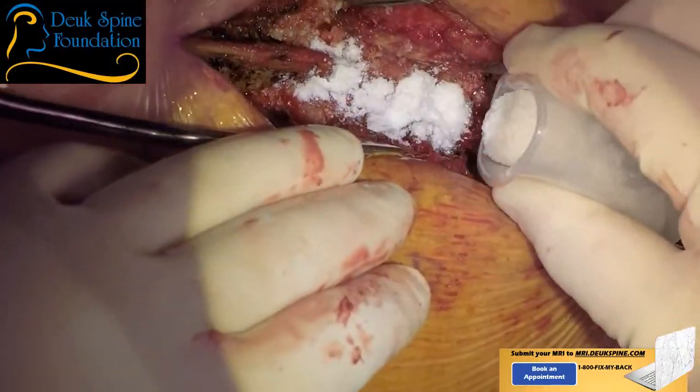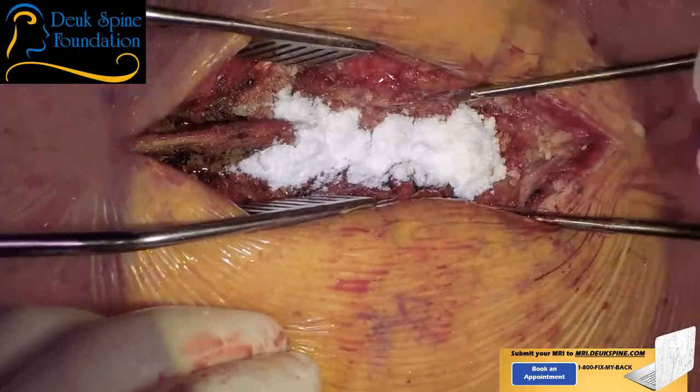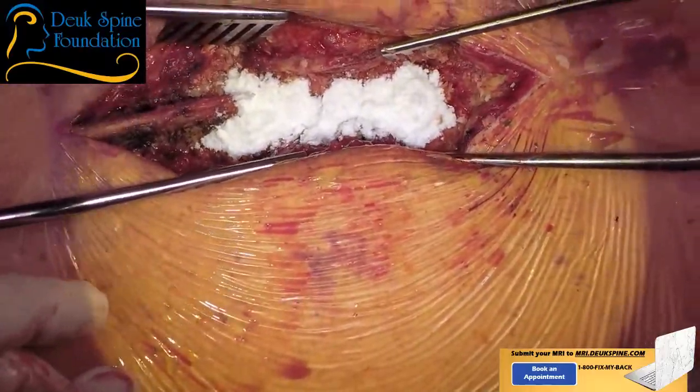Vancomycin's an antibiotic. That's really half a gram? It looks like so much. Is it just half? Yes, sir. Sure? Yes, sir. Okay, I believe you. You've got the Exparel? We have Exparel. I need the drain. While he does that, I'll do the drain.